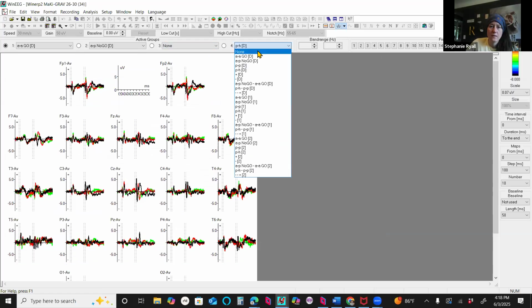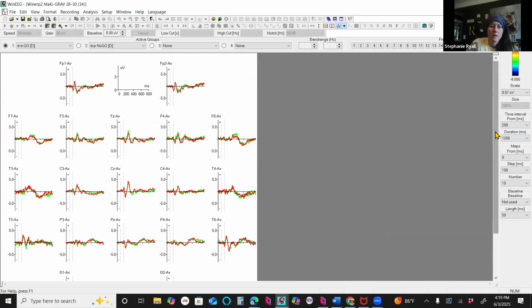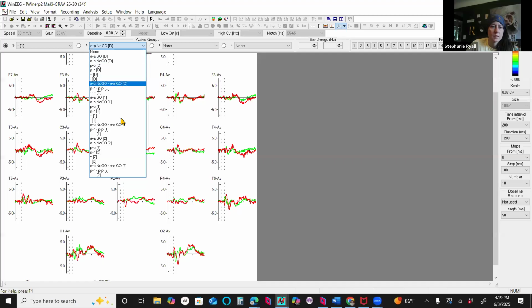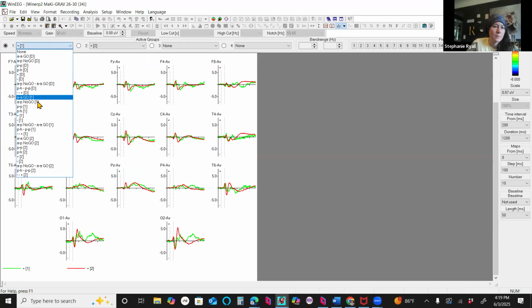You cut out the difference in the fourth channel. To look at the first stimulus, you go 200 to 1200 to see the beginning. Then you look at +1, +2. For +1, +2, you're looking at the first stimulus, the first animal, and how the person reacted in the visual system. Like this person, for example, had a rebound visual response. That's not normal and opposite of the visual perceptual function we usually expect, according to healthy subjects. So I would flag that and put that in my report.